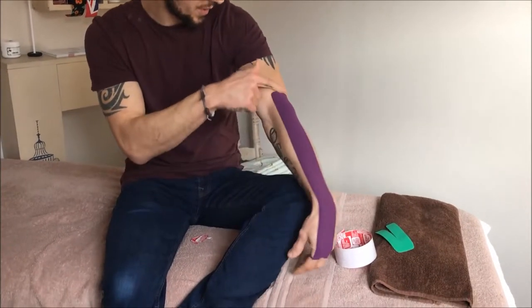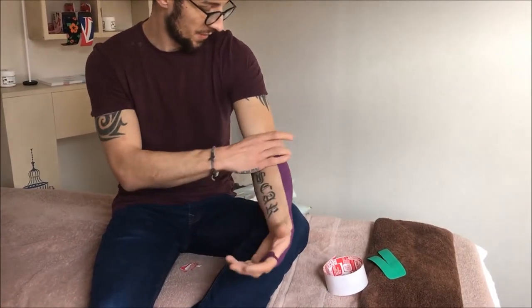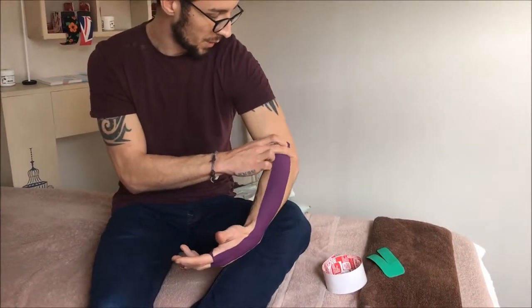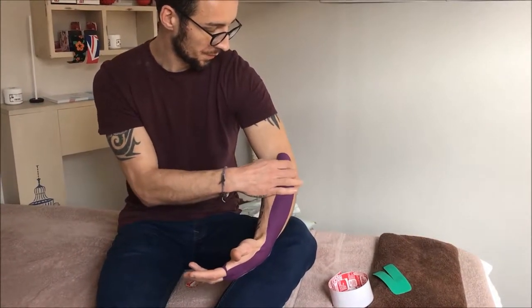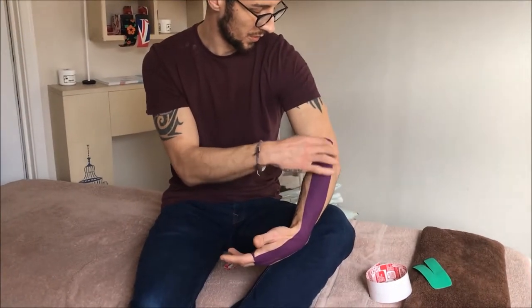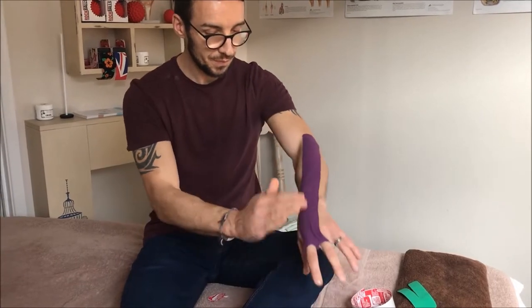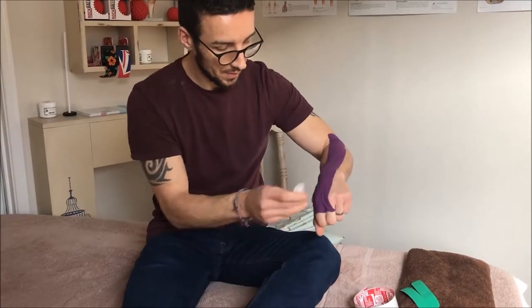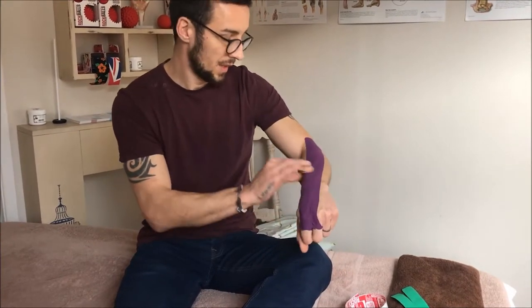To find where we want to finish: feel into your elbow and find the bony prominence on the outside. Come up from there and you'll feel a fleshy part — this is the common extensor tendon, which is what we're heading towards. Get onto that fleshy bit just above the elbow and smooth out any creases.